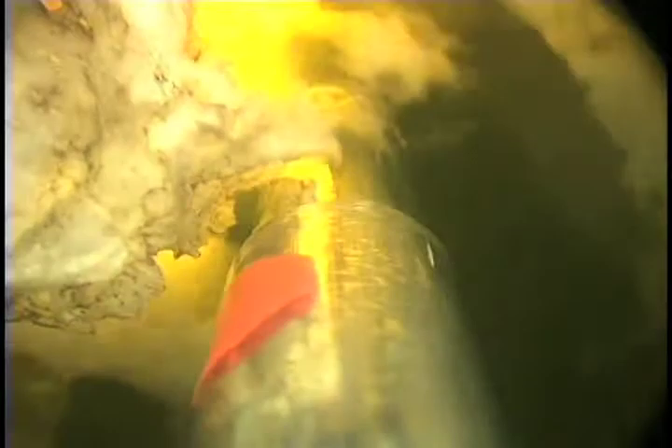We've withdrawn to the level of the verumontanum to see the anterior tissue from our 1 o'clock incision on the other side hanging into the surgical space. We move back to the 12 o'clock position and continue dissection along our pre-marked area of surgical capsule, working from a known to unknown direction. Note that the energy delivery is into the adenoma and not toward the capsule. We need to remove this tissue to eliminate recurrence and irritative symptoms from tissue hanging in the prostatic fossa.